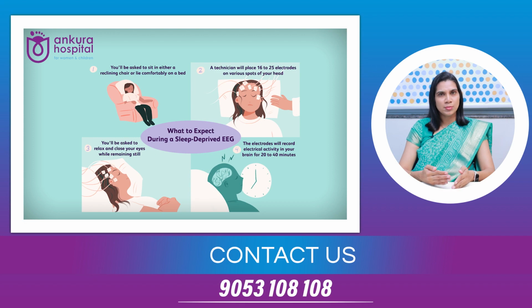Not only that, in sleep whatever changes we wish to see, or whatever changes we wish to know about the seizure, will appear more in sleep. So that is why a sleep record is very much required, and a minimum period of 20 to 30 minutes is recommended to know how the record is.